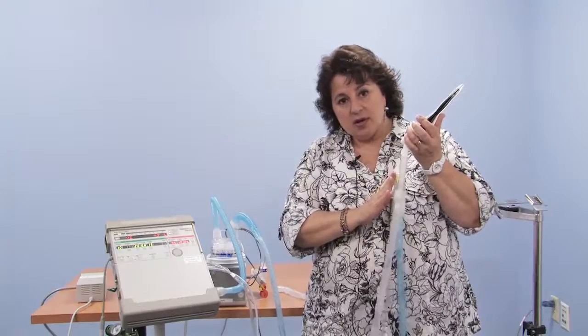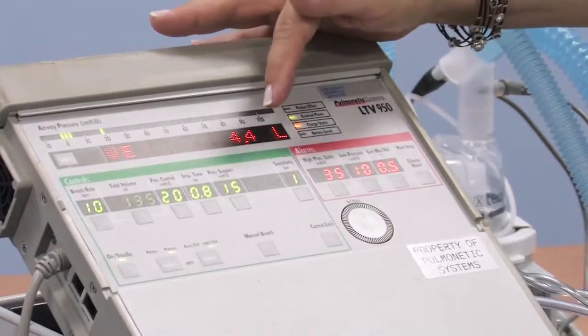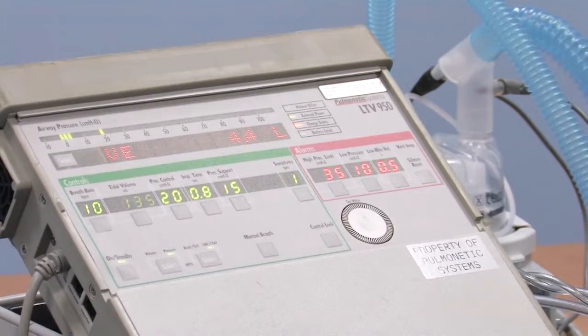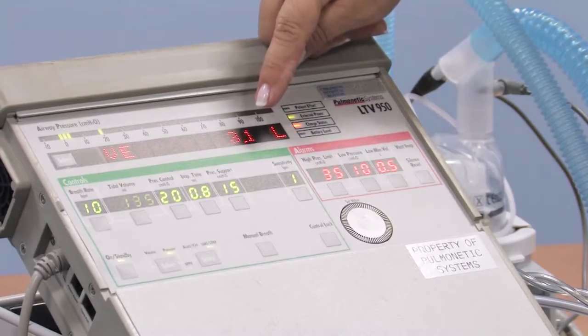These transducers here are watching the air coming out, and that's what they see. Now it's up to 4.4. So if the amount of air that your child's breathing is reduced because they had a plug, for example, in the tracheostomy tube where some secretions built up, this number would drop, and there is a corresponding alarm for it. So in the hospital, we set our alarm.